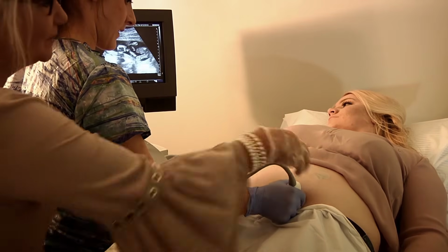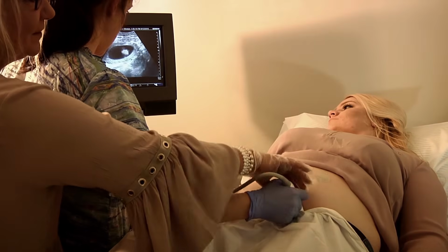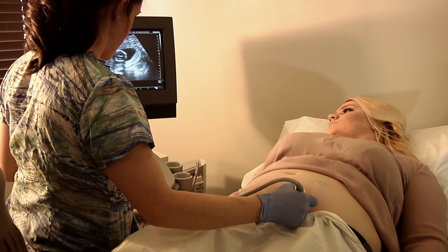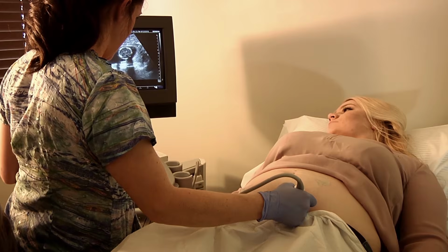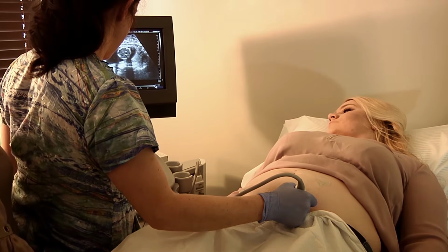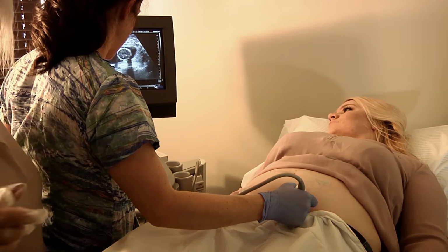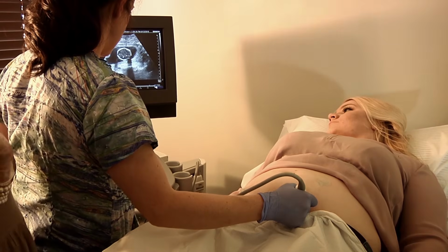Okay. Now we're going to go 90 degrees to the lie of the baby, and we're going to get a BPD. So you go counterclockwise. Just go ahead and turn all the way. Now this is your road. Now go. There's your head. And get a BPD. Now the baby's going to move. Oh, beautiful. Now you had a BPD in there. So go back and steal it. You guys can cheat. If you see a BPD or a femur fly through, stop and get it.